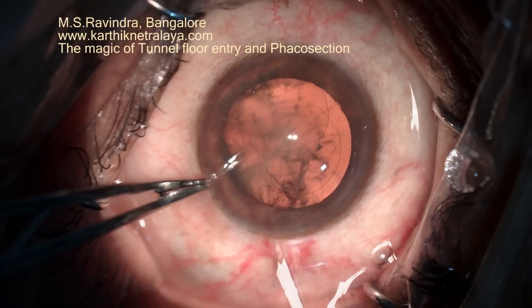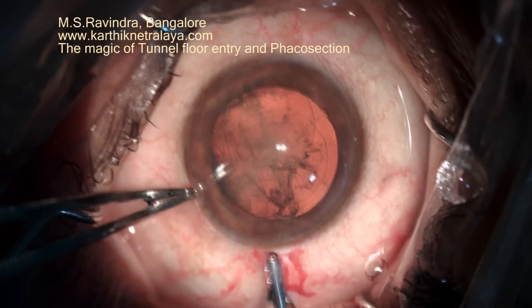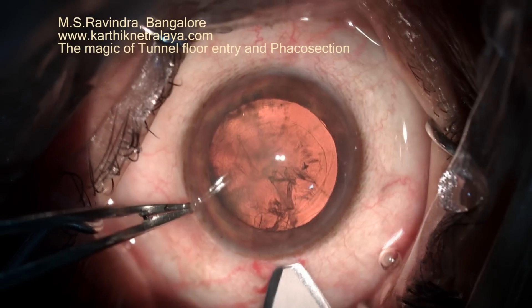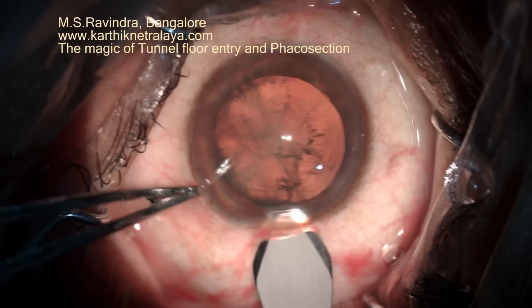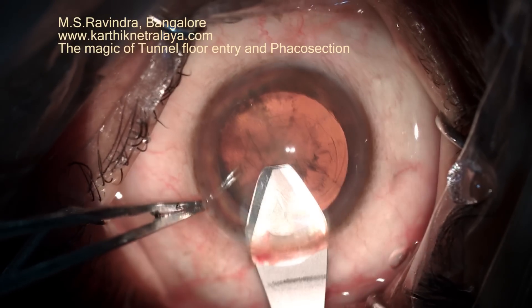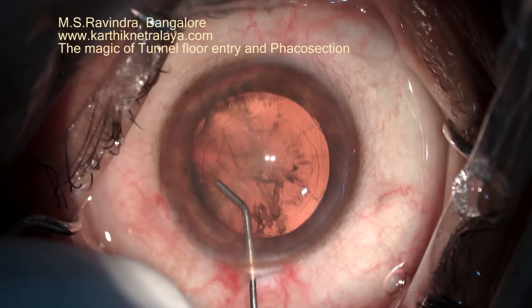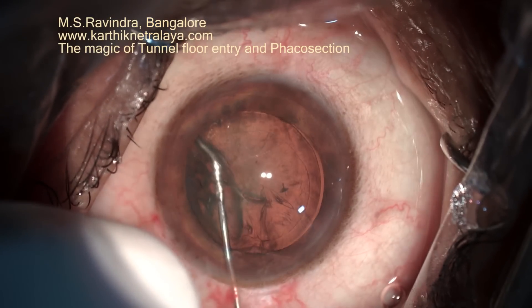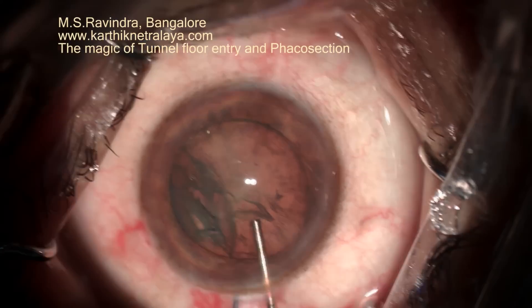1% lignocaine is infused into the anterior chamber, viscoelastic is injected again, and the tunnel is enlarged with a modified hydro-dissection cannula.